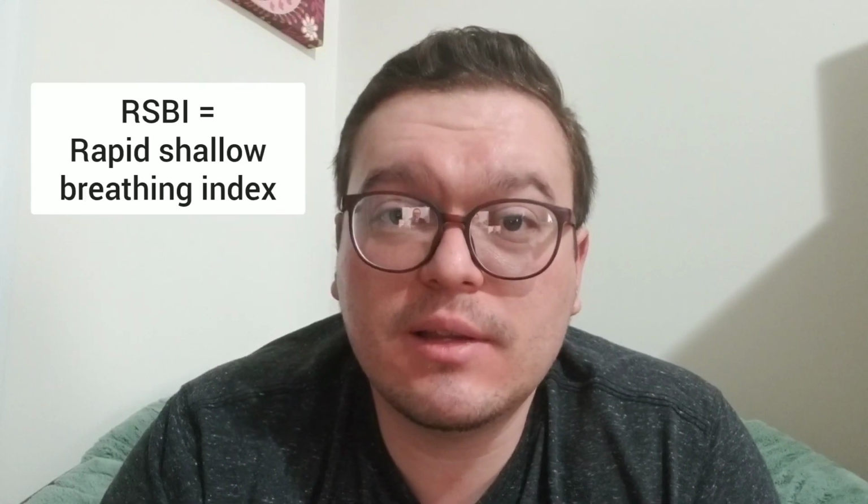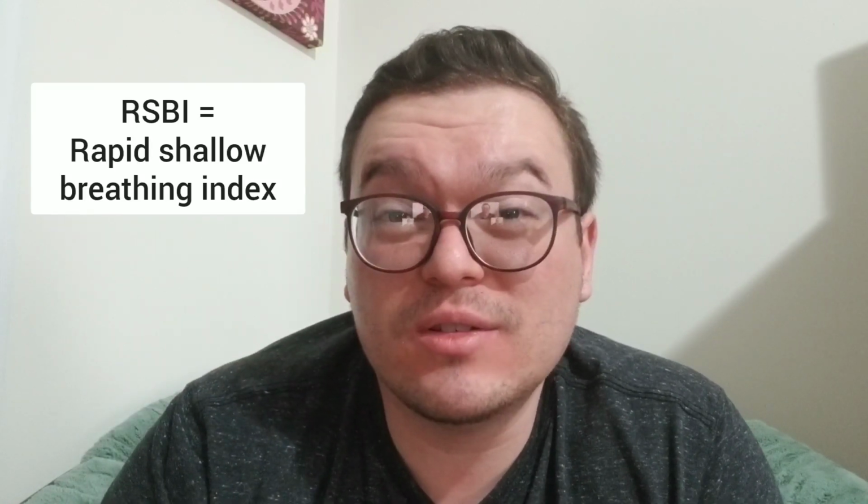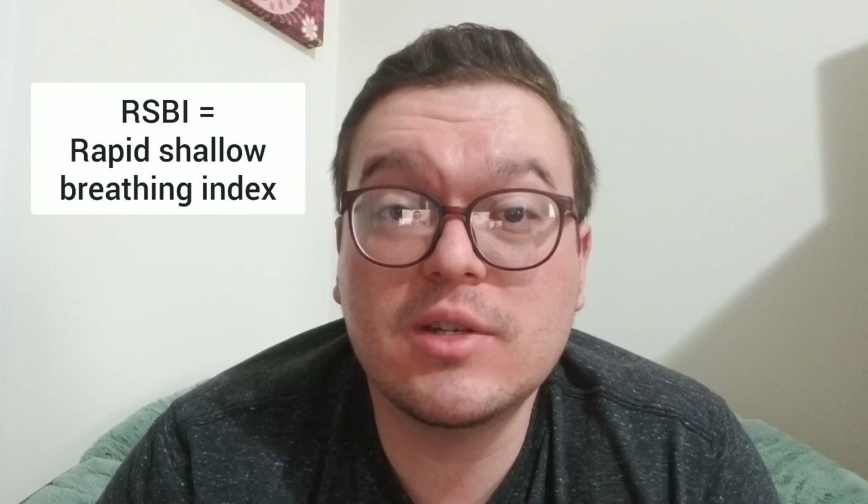Most respiratory therapists will also do spontaneous breathing trials on a daily basis, unless the patient's on max vent settings, to try to see where the patient is at. If you see anything less than like 105, that's good. The shallow breathing index is the respiratory rate divided by the tidal volume in liters.